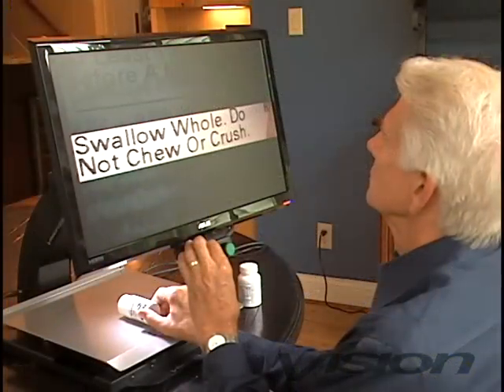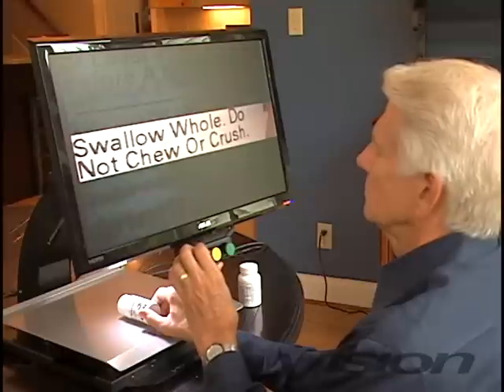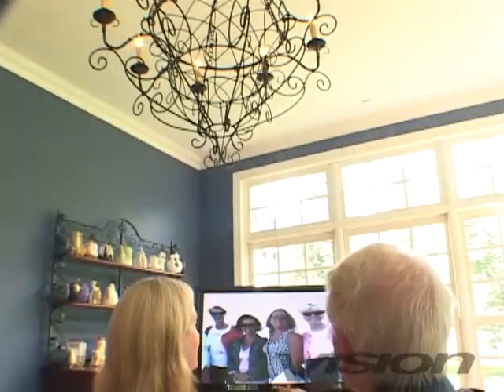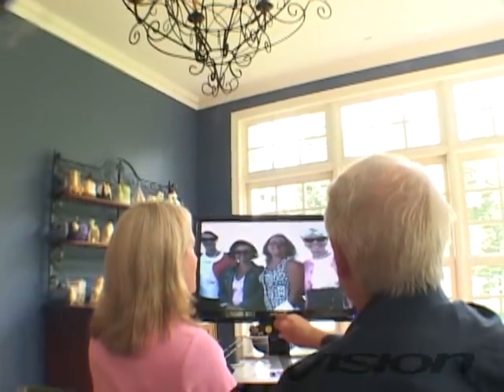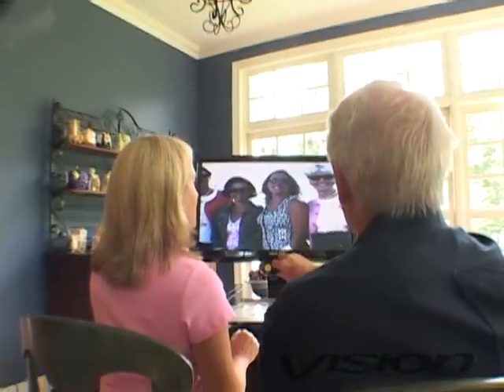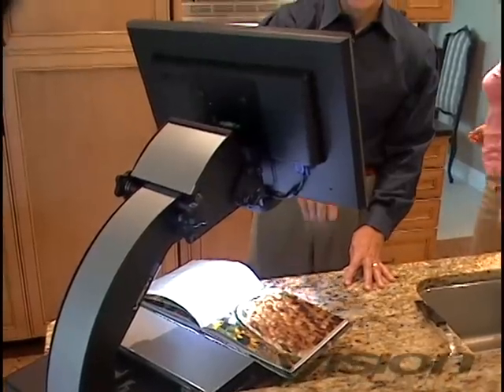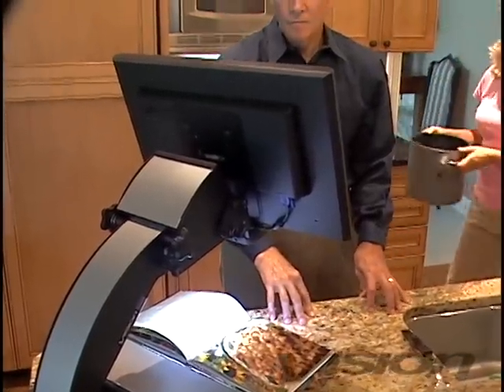Freedom Machine has line markers and shading making reading easier than ever before. The true color imaging of Freedom Machine guarantees that when you view pictures of any color, they appear that color on the display. The compact footprint of the Freedom Machine enables it to be placed in any room in the home for maximum usage.